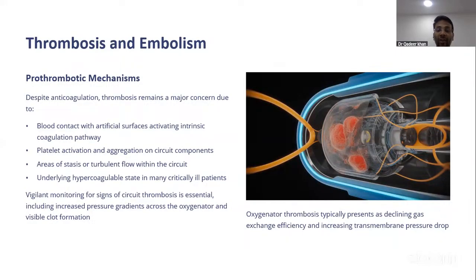The main idea for initiating ECMO is to maintain a proper delivery of oxygen. Your delivery of oxygen can be hampered if your membrane is getting clogged or thrombosed, so there are different methods to understand the membrane function. We measure the pressure differences, the P1, P2 pressure gradient, wherein P1 is the pre-membrane pressure and P2 the post-membrane pressure.